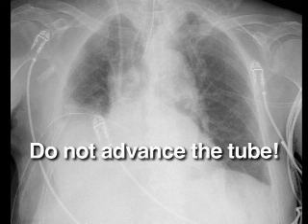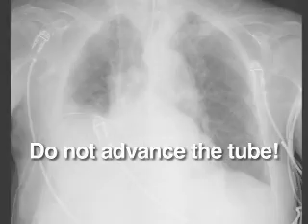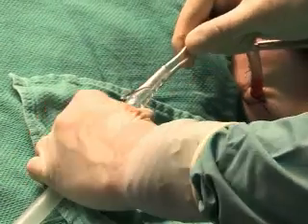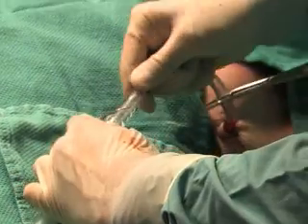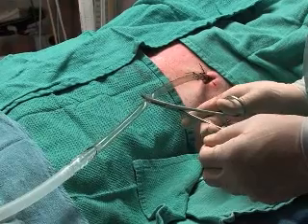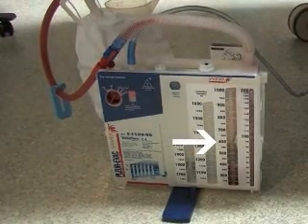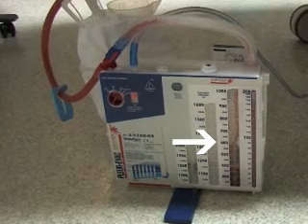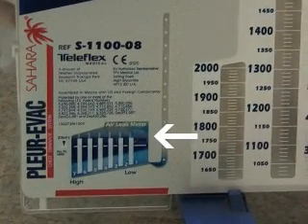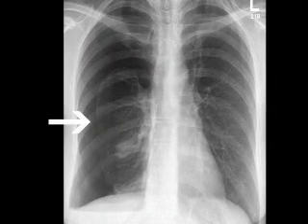Do not advance the tube into the chest, as this can introduce non-sterile tubing into the chest cavity. Before unclamping the free end of the chest tube, firmly connect it to the sterile drainage system. Now unclamp the free end. If pleural fluid is being drained, the fluid level in the drainage system will rise. If a pneumothorax is being evacuated, air bubbles will appear. Do not reclamp the chest tube while there is bubbling, as this may lead to recollection of a pneumothorax or even a tension pneumothorax.